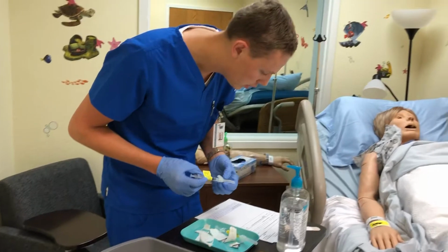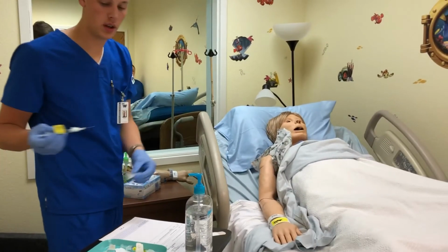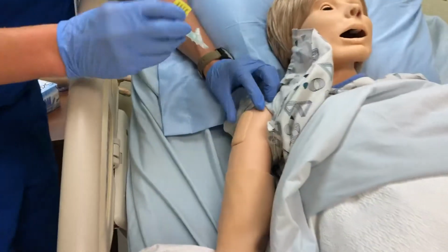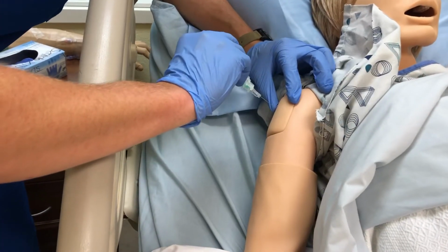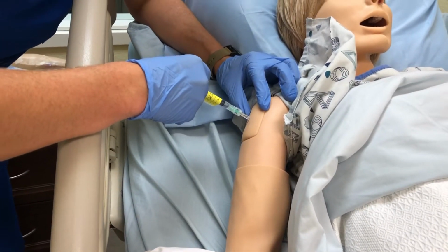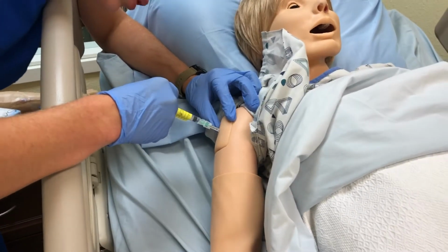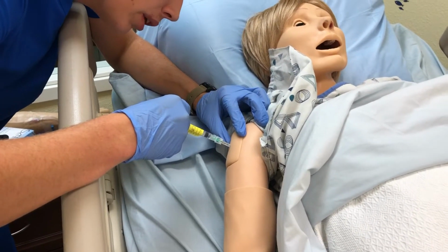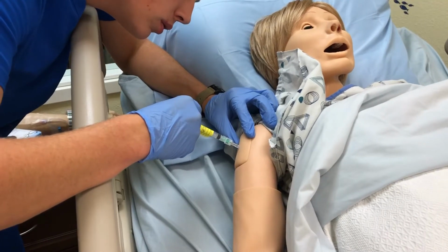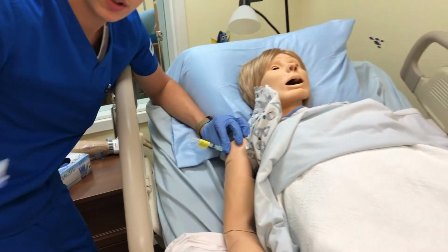That's the Phenergan. Okay, and then we're just going to pop that off. Okay, Shirley, so you're going to feel a slight poke. Okay, 1, 2, 3. And we're just going to go nice and slow at a rate of, since it's going to go about 0.1 per second, so we're going to go at about 5 seconds. Okay, and then we're just going to hold it there for a couple seconds.